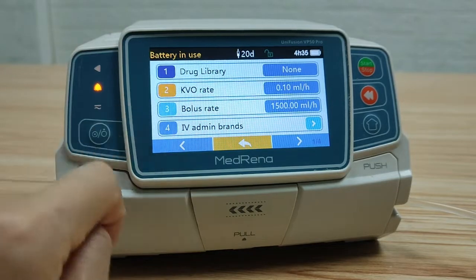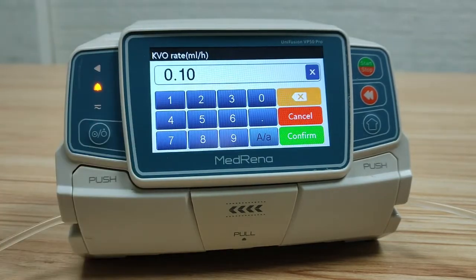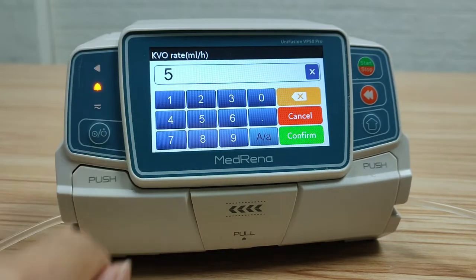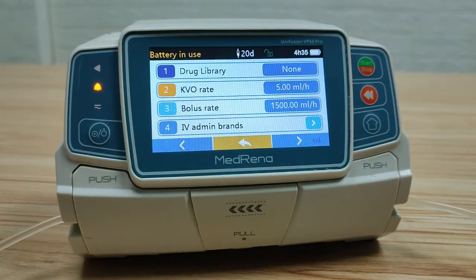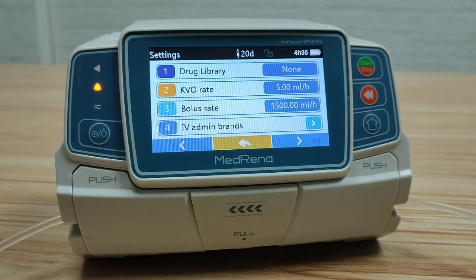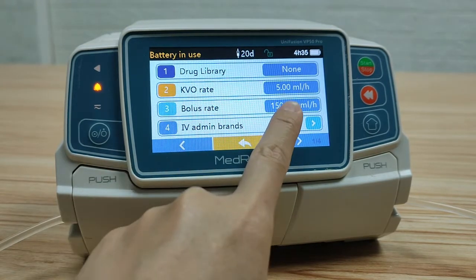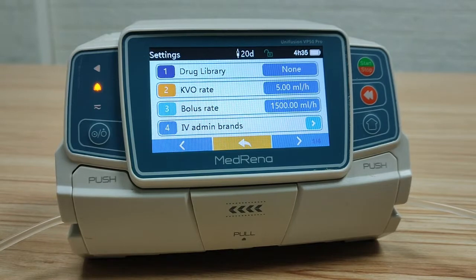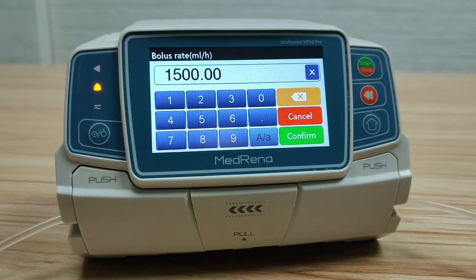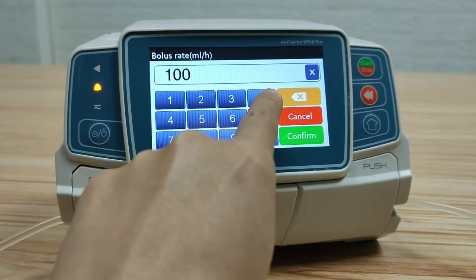Next is KVO rate. We can add another bolus rate as needed — for example, 1000.